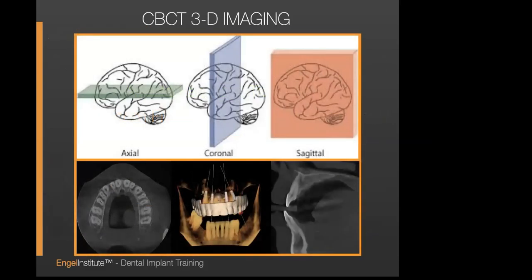Now, obviously, as you all know, you have all been very privy to CBCT. I remember when I started speaking about 18 years ago nationally, very few people had digital sensors. Now everybody has a digital sensor, and 2, 3, 4 years ago, GPs were starting to get into CBCT. As the prices were coming down, the fields of use were expanding for the money, and so now most of you are either in it, looking to get in it, or very close to that.